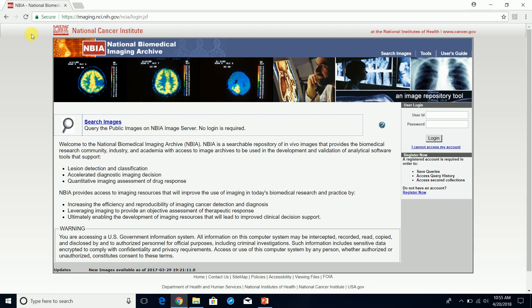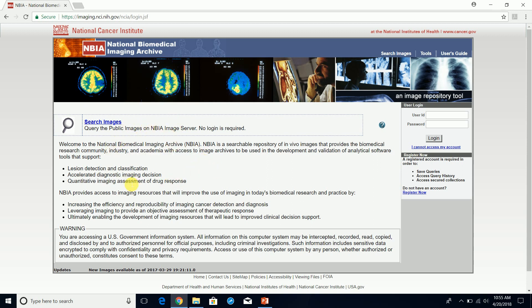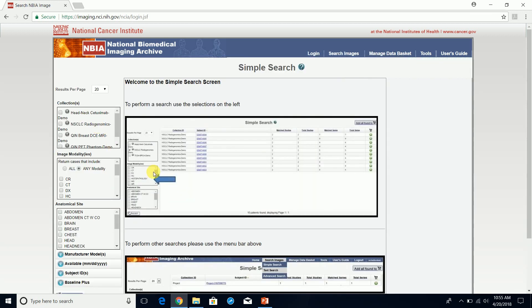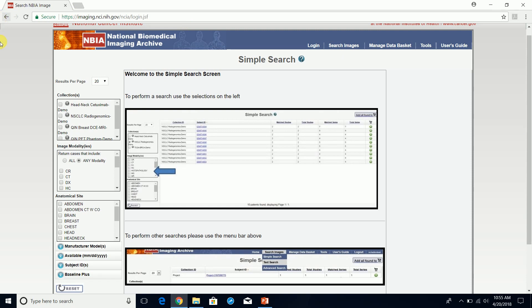This is the National Biomedical Imaging Archive. This is a public image repository for the research community, industry, and academia. There is no login required. I found this by doing a Google search, trying to find DICOM images for testing, research, and academic purposes.